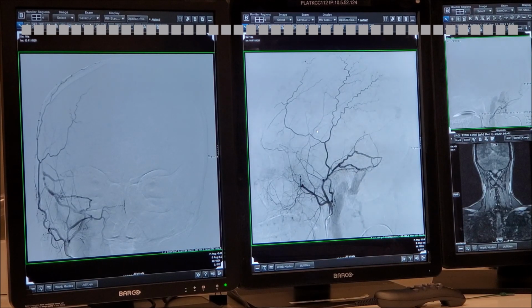And there is stenosis of the sinus without a dural fistula, and that's the one that Cornell primarily, Dr. Goban, came up with stenting a stenosis, but that's another topic. Okay? So what are you going to do with this lady? The choices are between transarterial and transvenous.